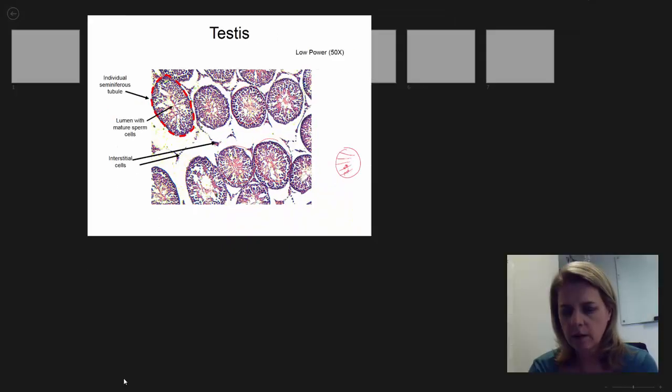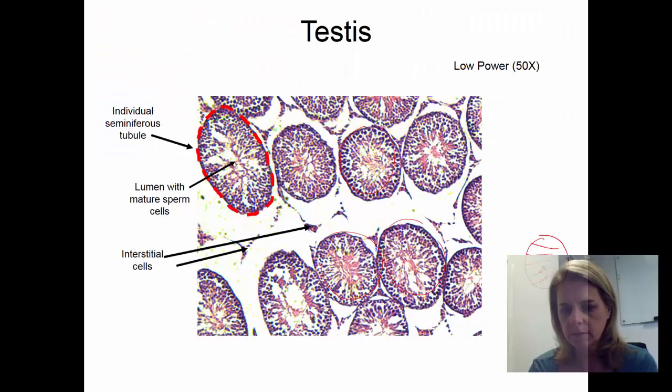Let's see if I can, whoops. Hang on, let me make it a little bit darker or wider. Better, sort of.